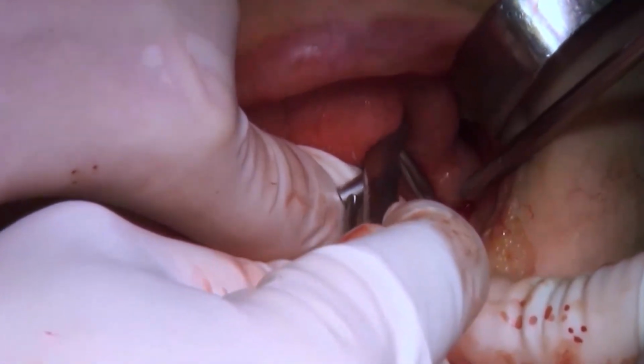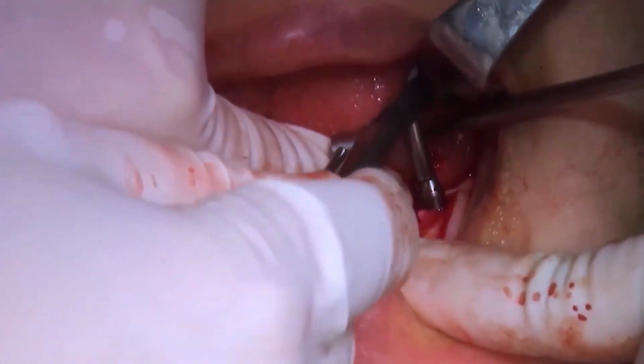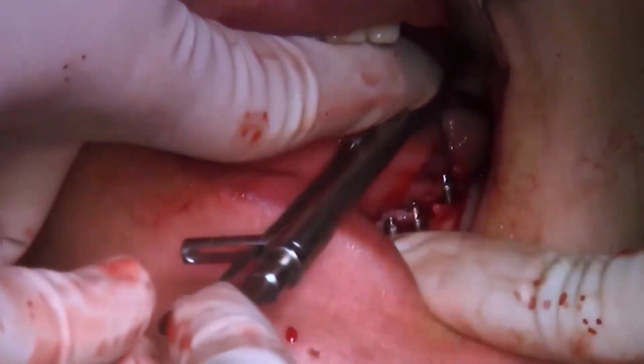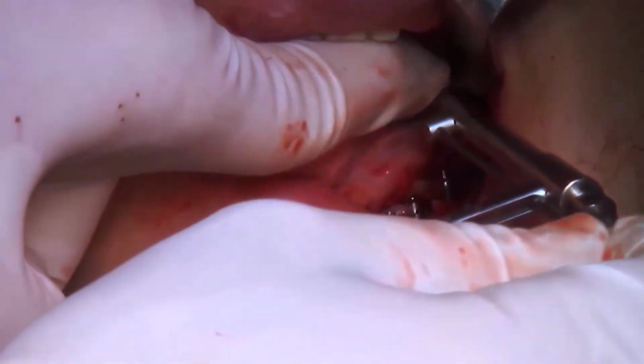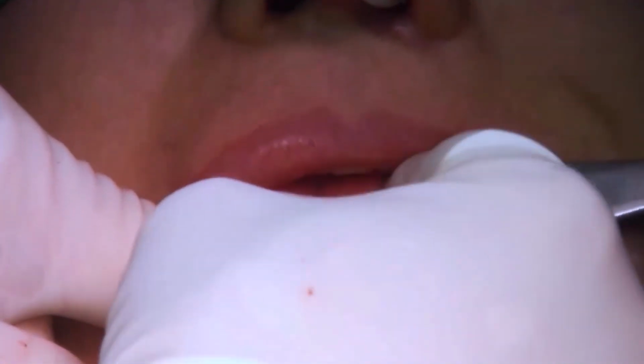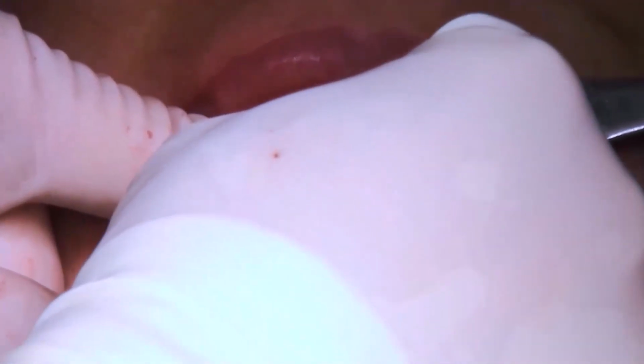All abutments are fixed with a torque of 30 Newton centimeters. And then the temporary cylinders are connected to the abutments. The cylinders are slightly tightened by hand.